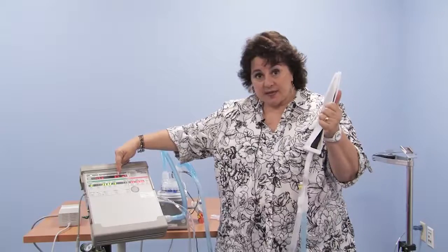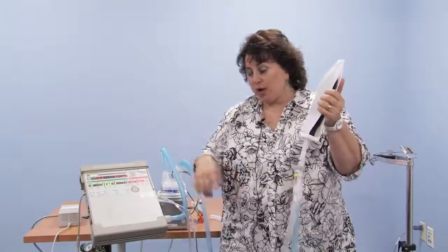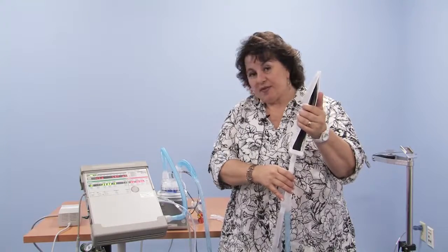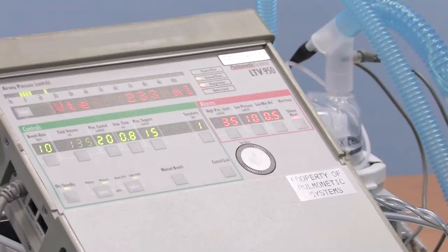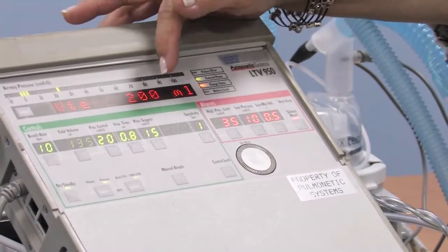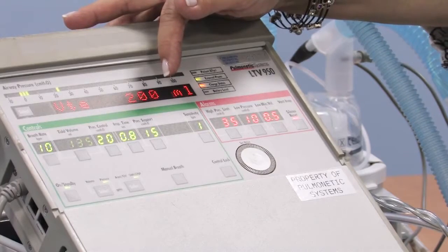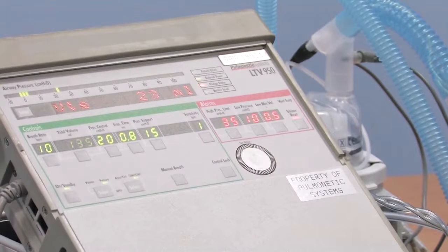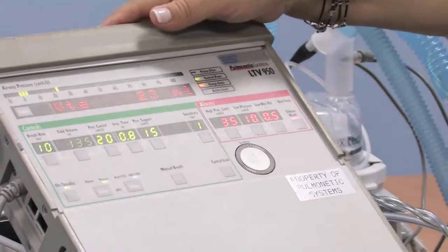What we had was a larger, much larger breath. Watch. I let the lungs go. 200, 150, 200, 150. I close the lungs down. I tighten them, I plug the trach tube, the number is going to go very low. Your child won't be getting much air. They will be having respiratory distress. If you have an oximeter on, you will see desaturation and likely change in heart rate.